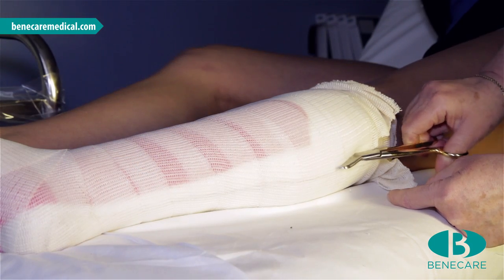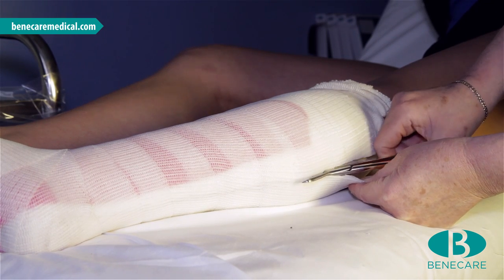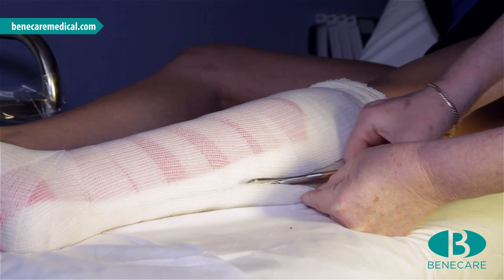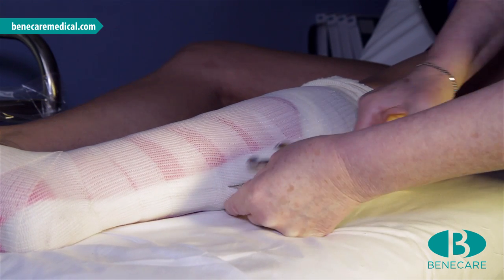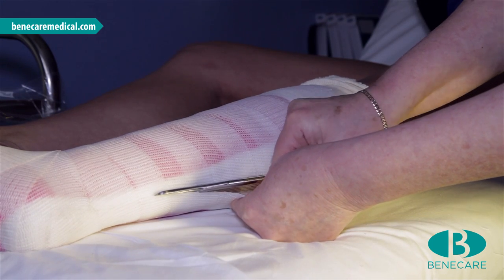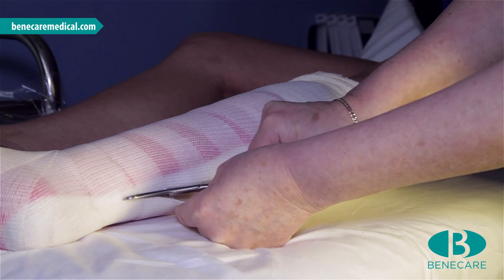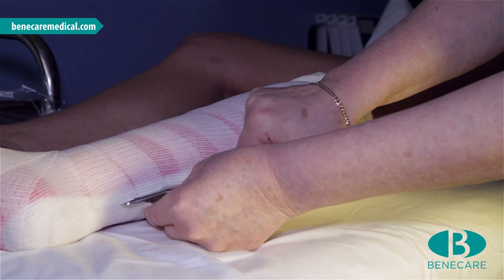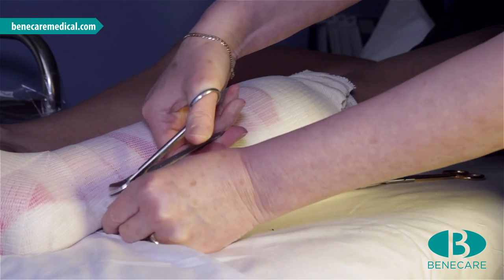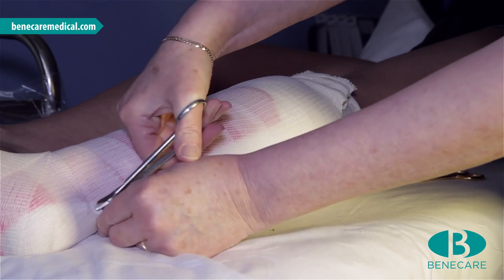Cut along the guideline, putting the scissors just under the piece of stockinette that is integral to the cast and running along the stockinette used as protection for the patient. Keep your scissors parallel to the patient's limb. As you come down to the heel, you may feel a little pressure on your scissors — at this point, switch to surgical wire cutters, often referred to as nibblers.